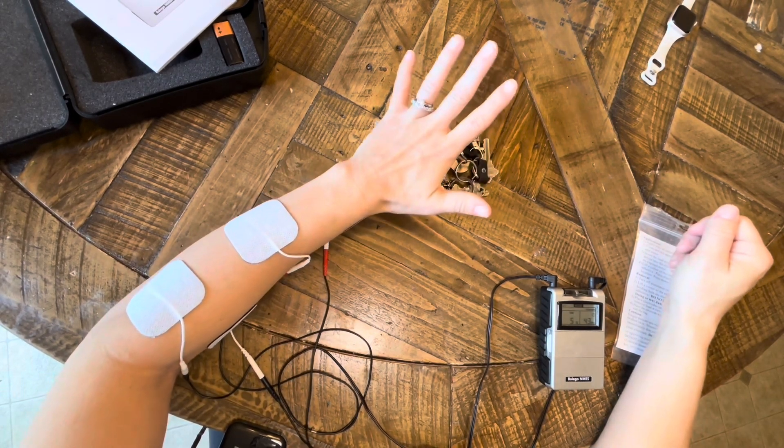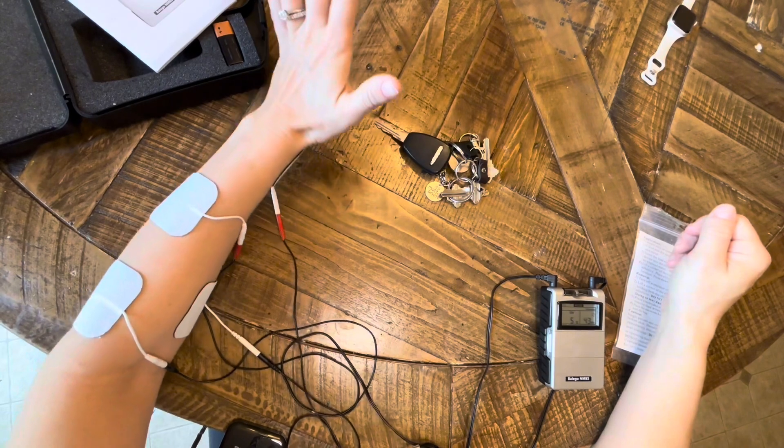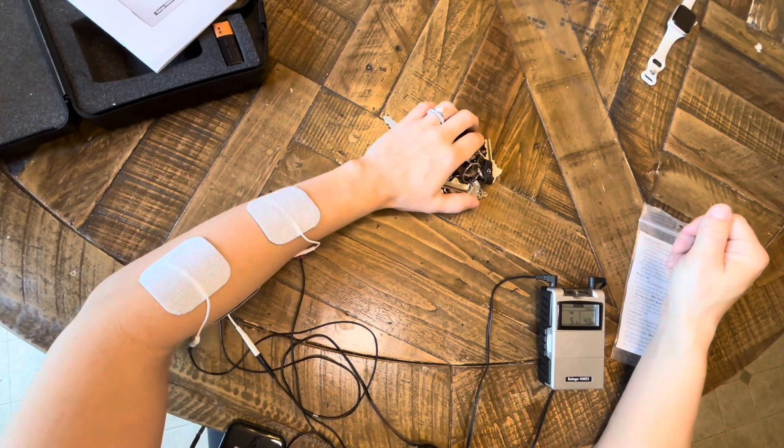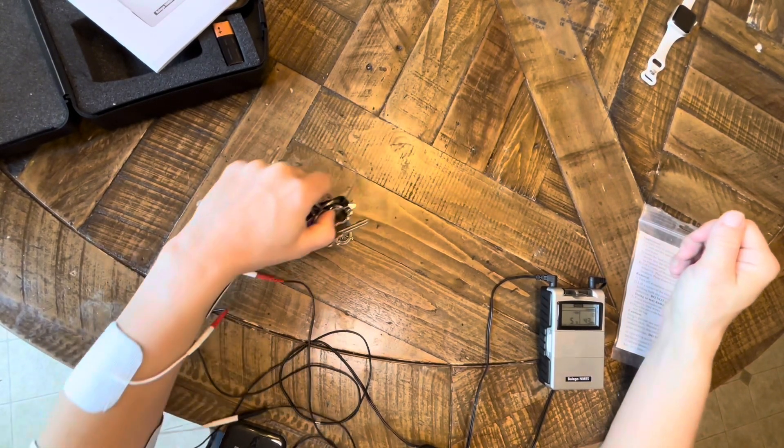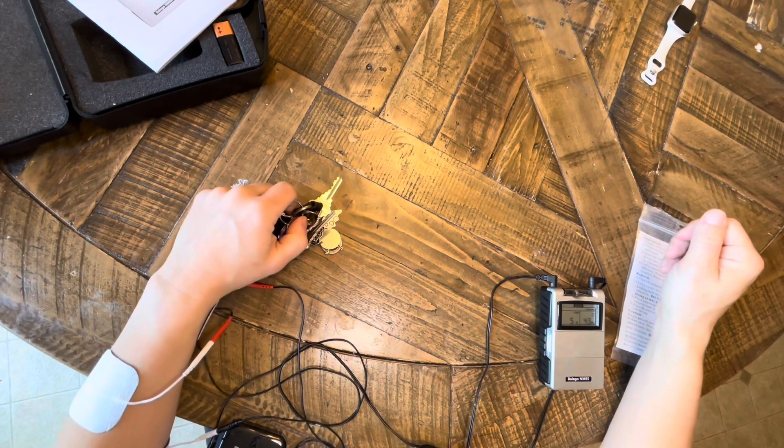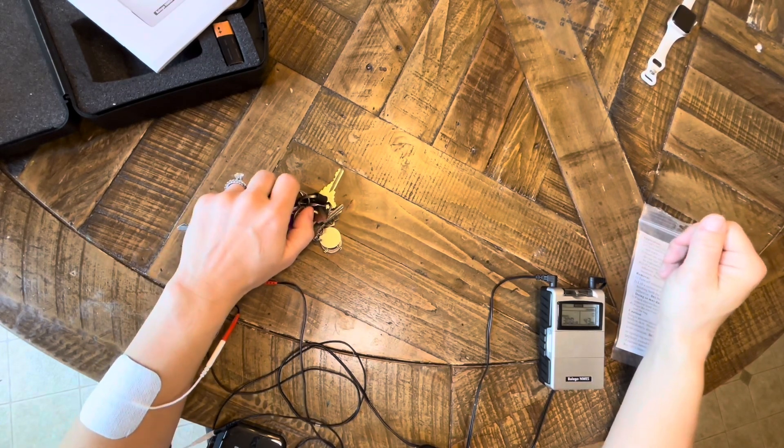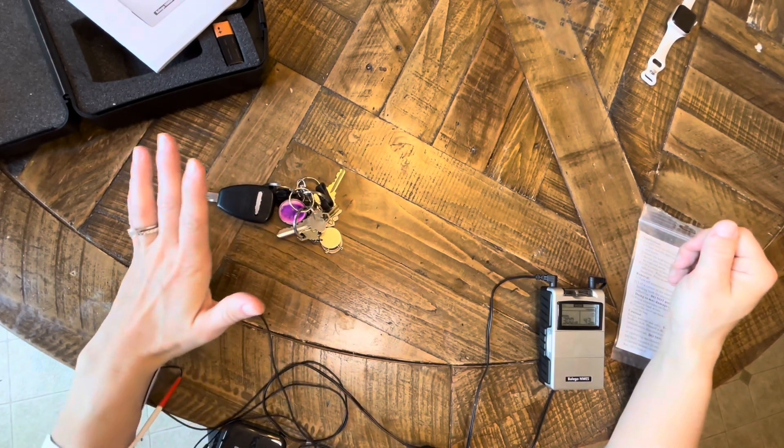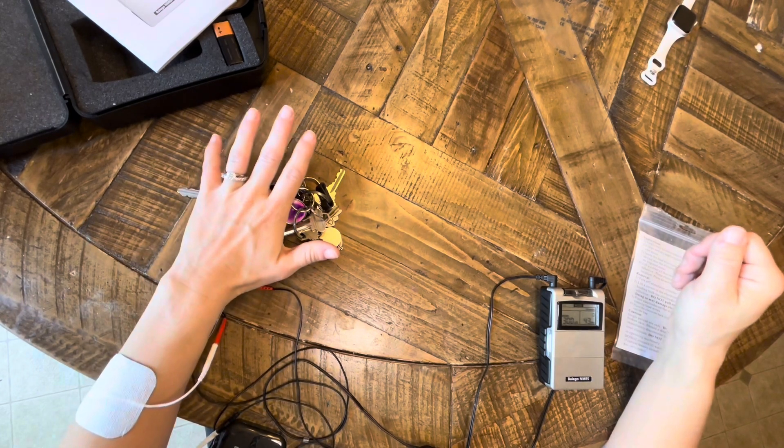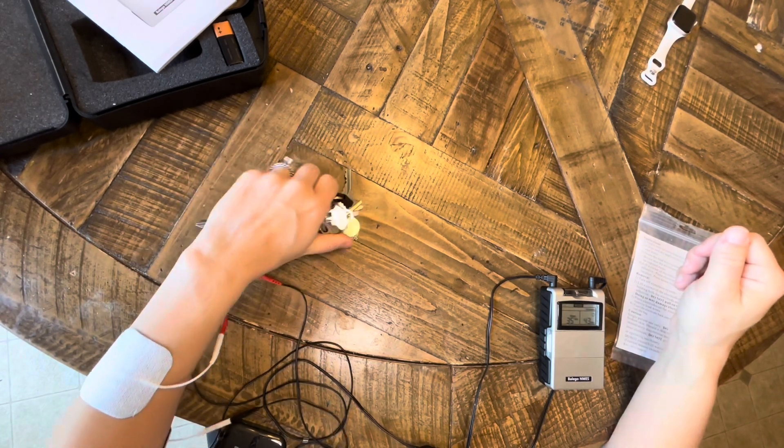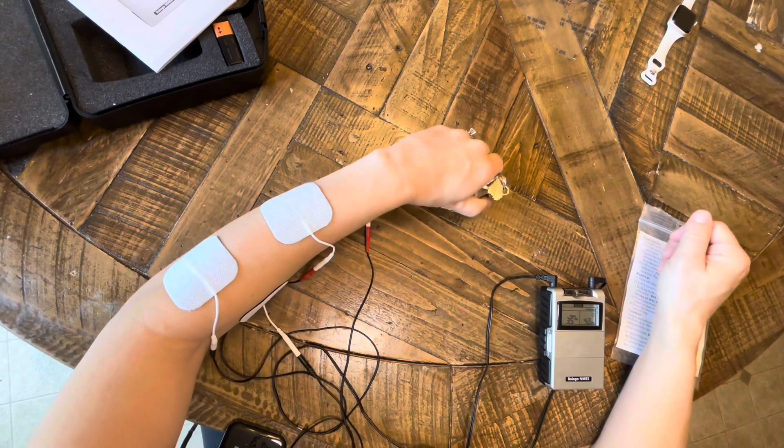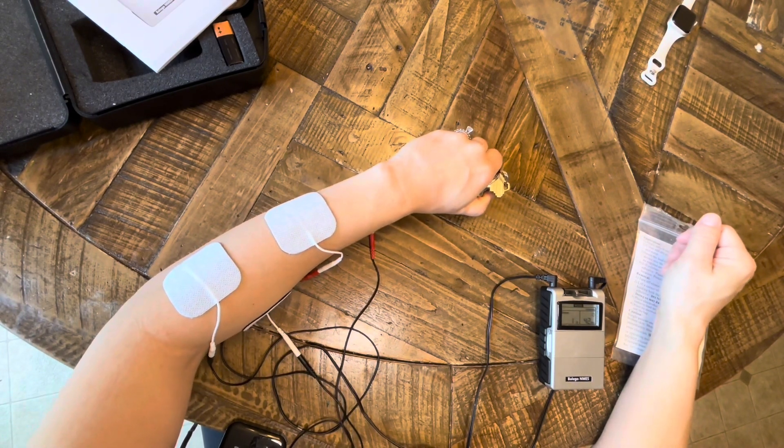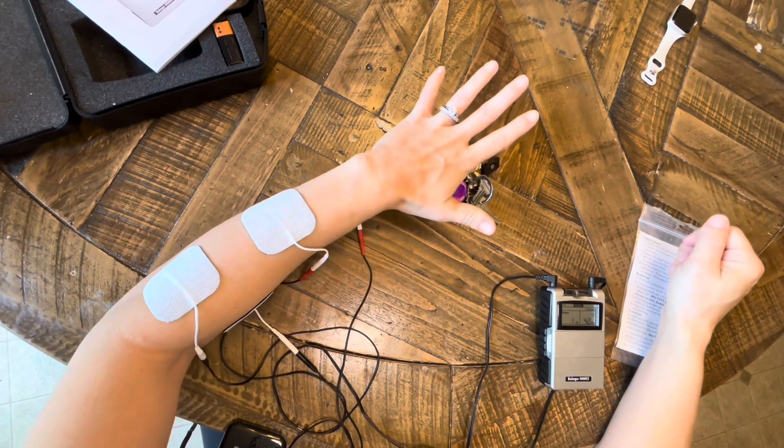And you can really make this activity more complicated, right? Like if your patient has elbow and shoulder movement, or you have a mobile arm support, getting that arm to move just a little bit more than just picking up and setting your keys down—maybe carrying them across the table, raising it up, setting them on a shelf, into a container, whatever you want.